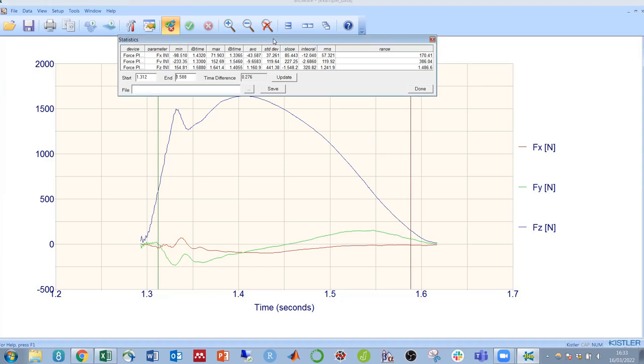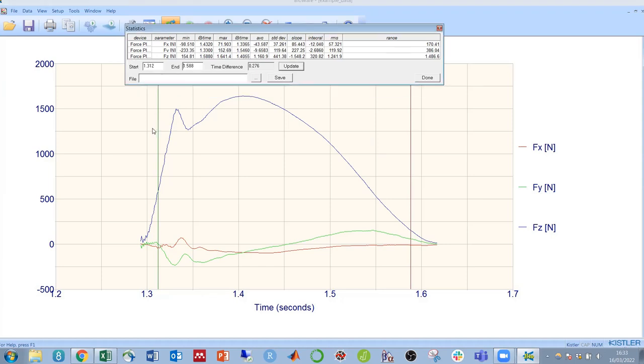The values that we are given are all calculated between the two time points, and they include in our x, y, and z directions, the minimum and maximum force values, and the time at which they occurred.